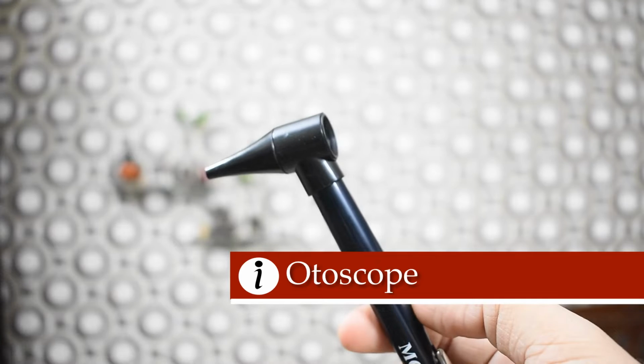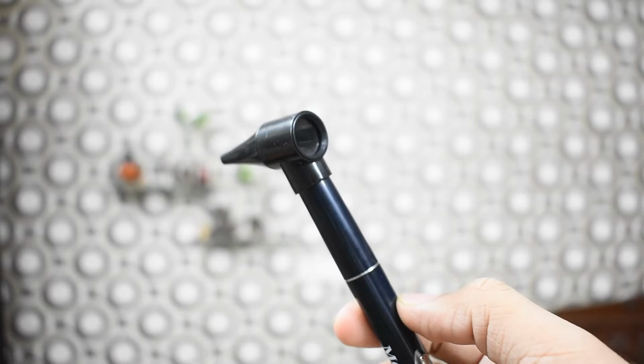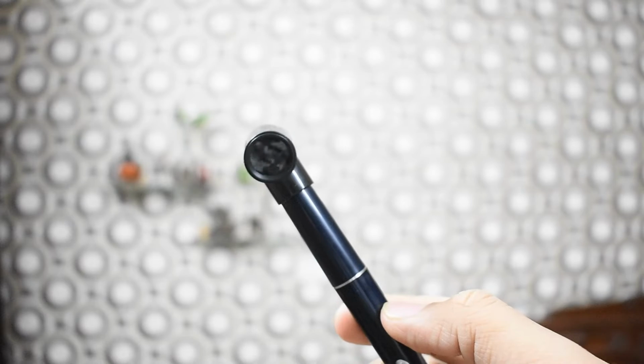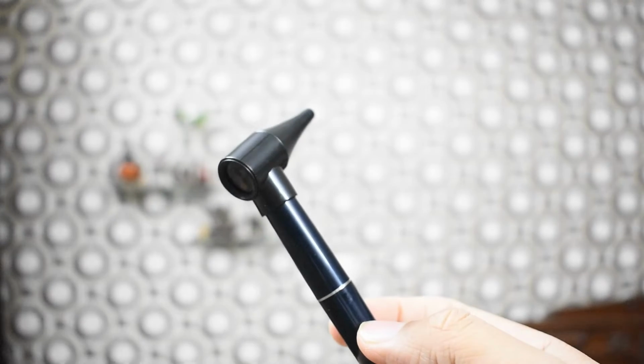Examine the ear canal and the eardrum using an otoscope. An otoscope is a tool which shines a beam of light to help visualize and examine the condition of the external auditory meatus and the tympanic membrane. Choose the largest possible speculum for the patient in order to maximize the light passing in the ear.